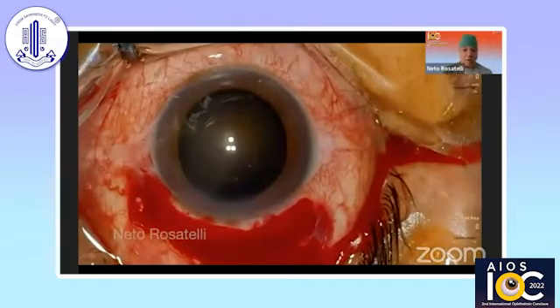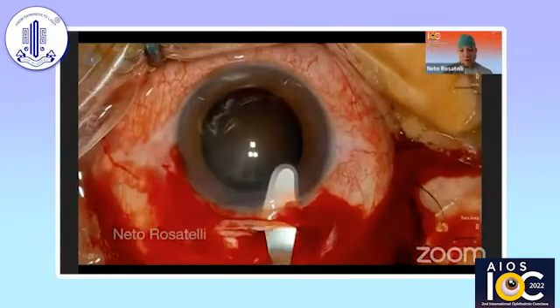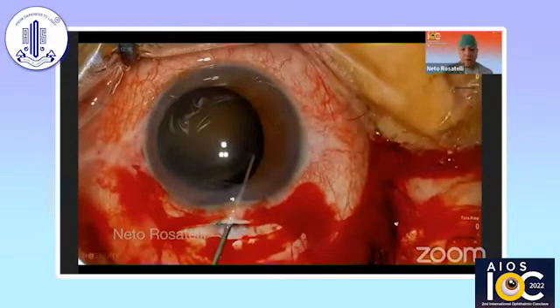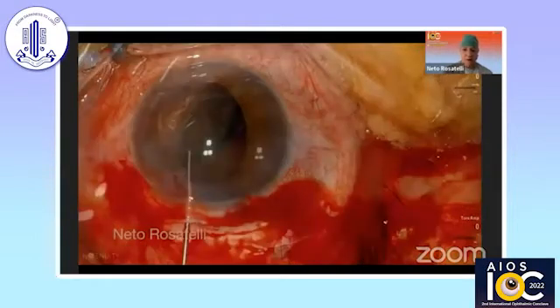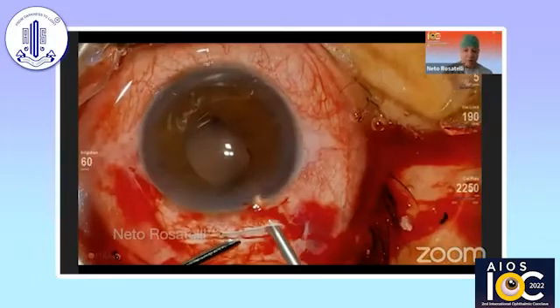One modification is to do two side ports — two opposing side ports to allow for the suture tying, as I will show later. In this case, the crystalline was completely luxated. So after removing the nucleus, adequate vitreous management is done.